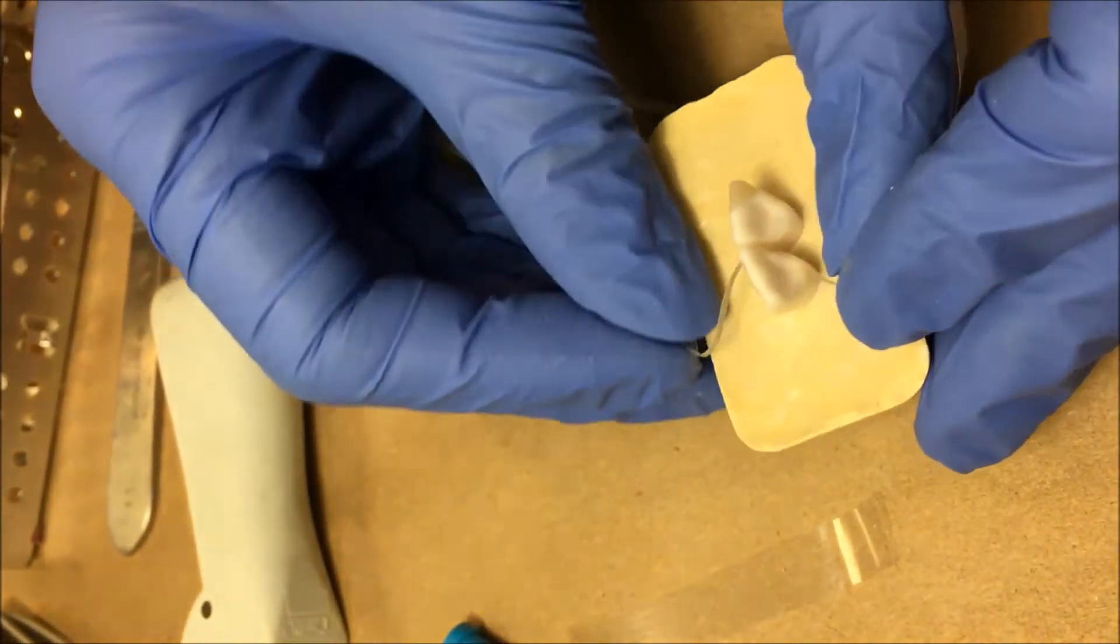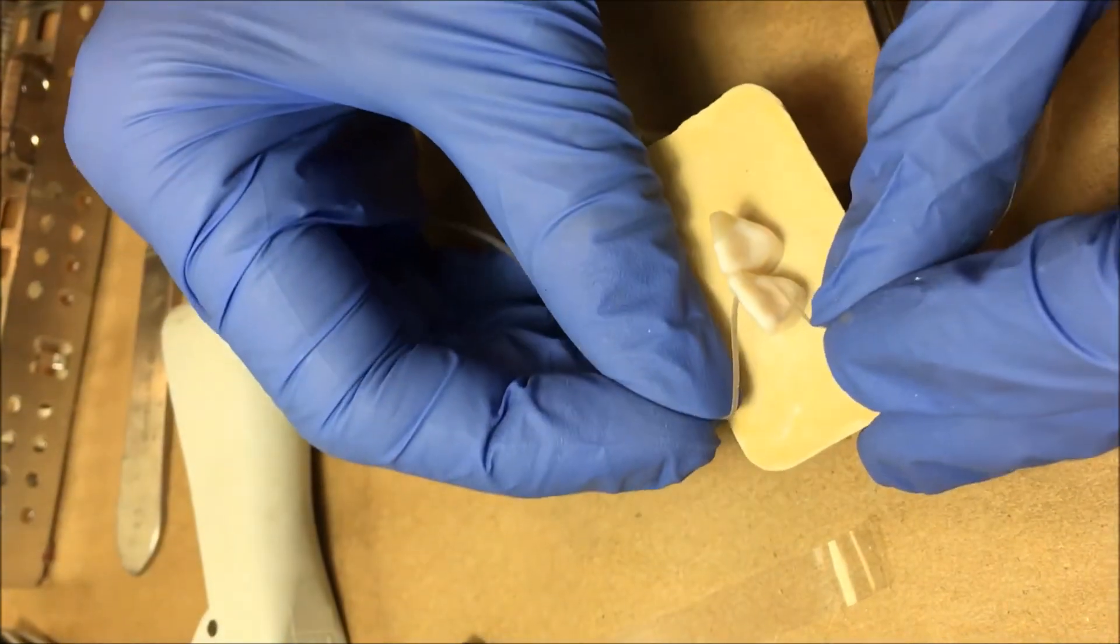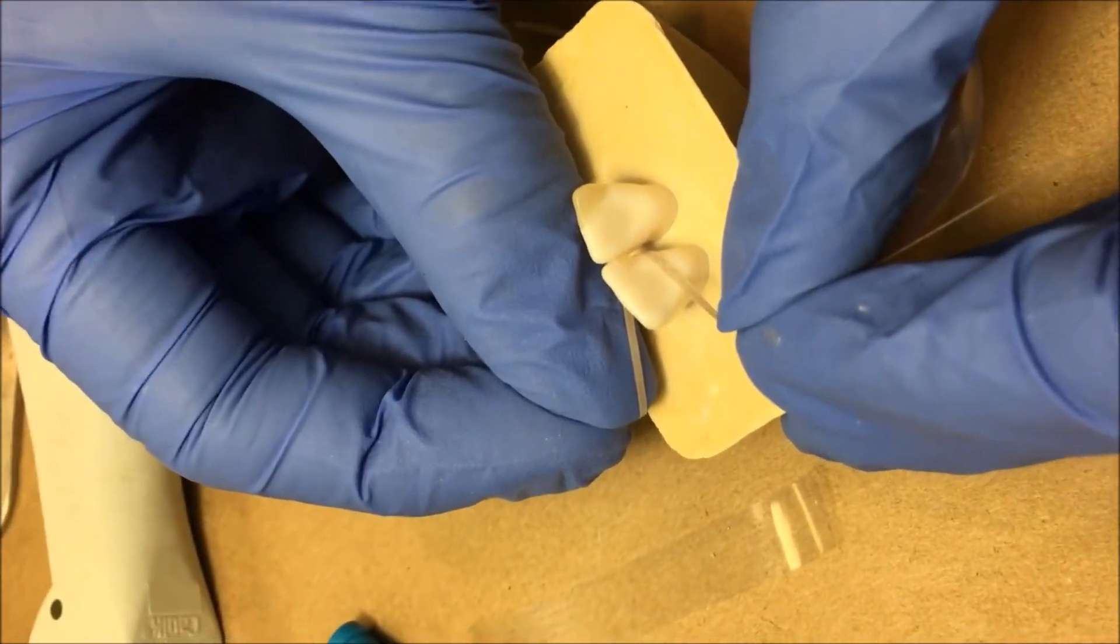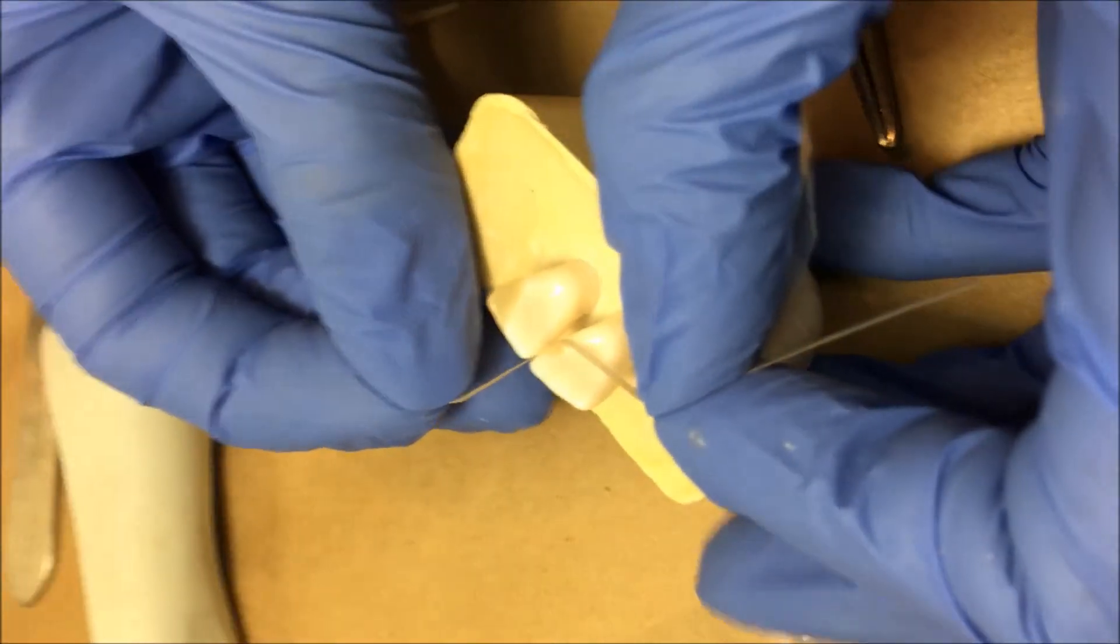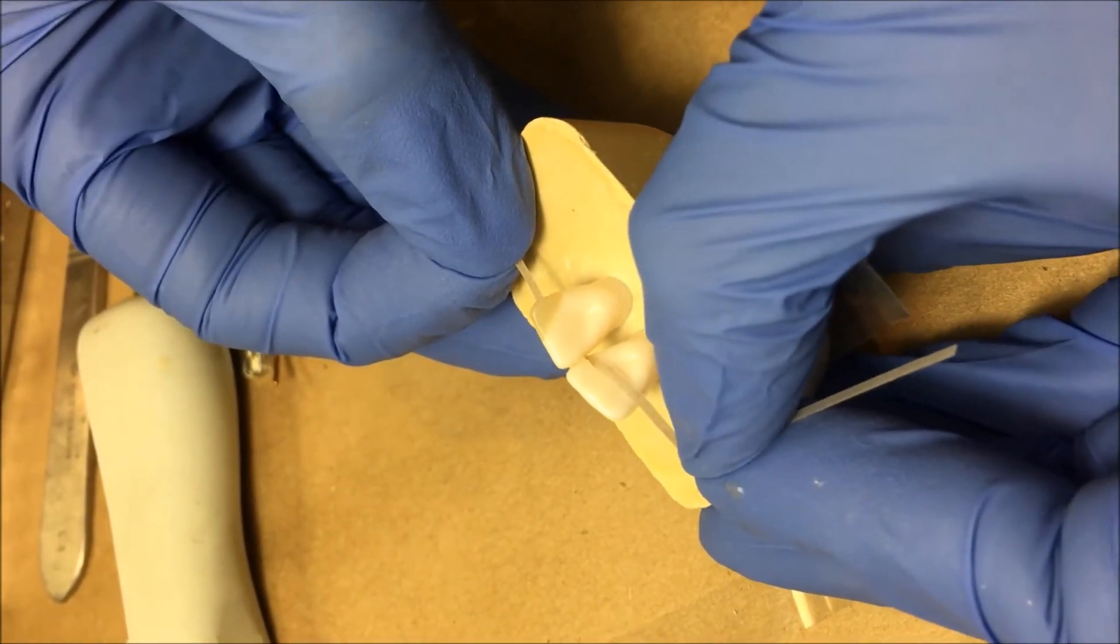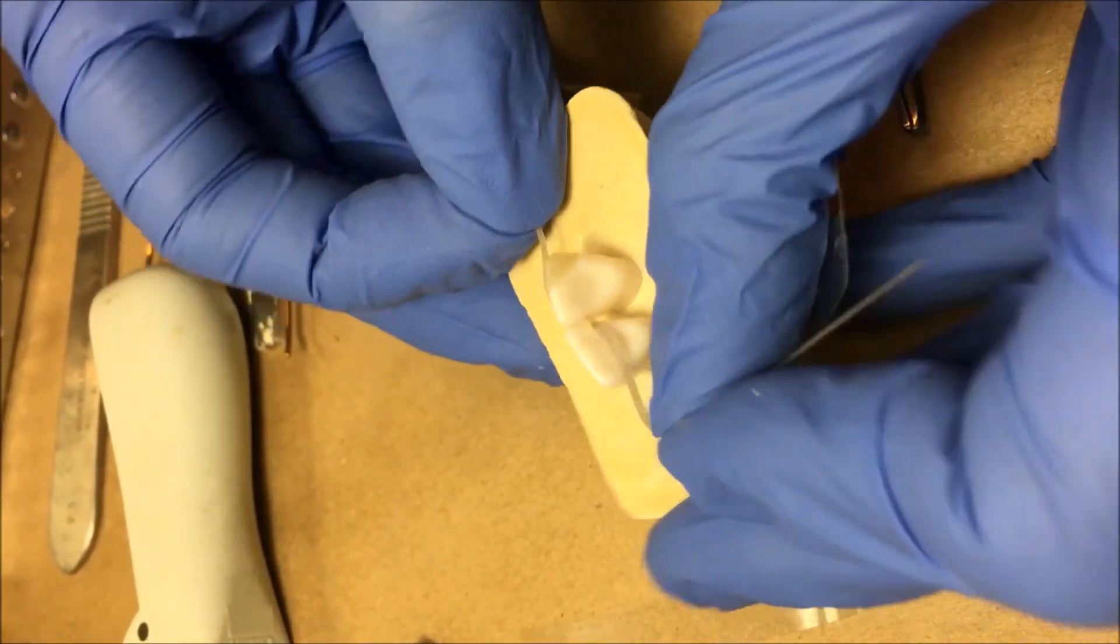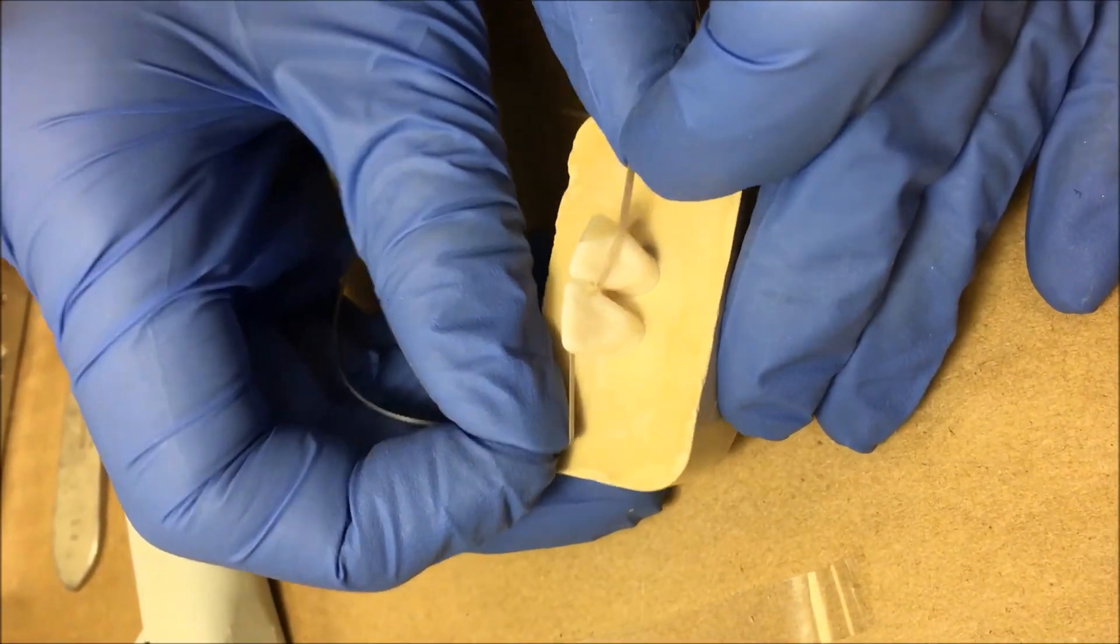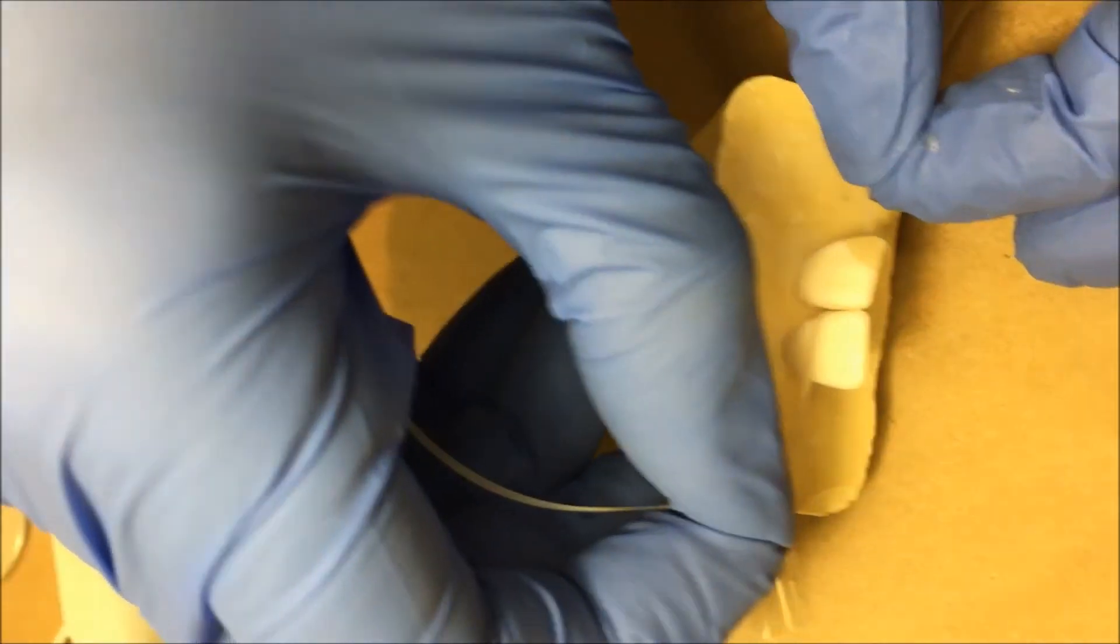You can do this in a C shape or the S shape depending on where you want the pressure to be sanding off composite or flash. Right here's your C shape and we have pictures of this but here's your S shape. So in this case this is working on the lingual. If I change the S shape around where is that one working now? It's working on the facial.